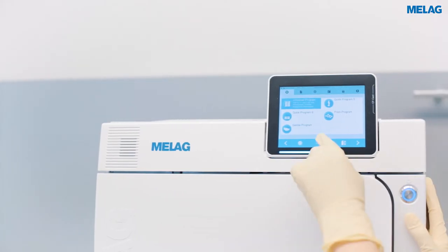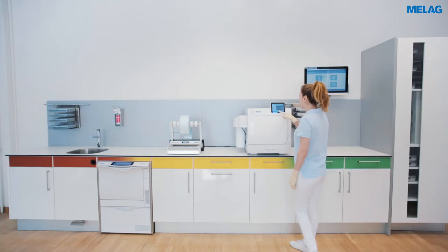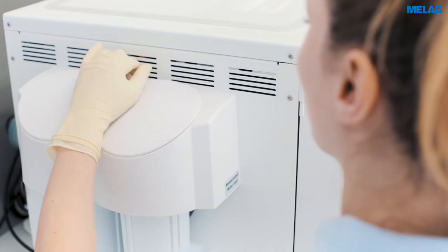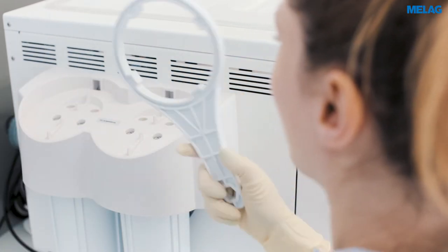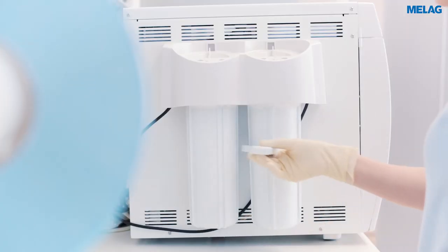Then start the universal program and abort it after about 20 seconds. You can now open the cartridge container using the wrench in the housing cap of the Meladem 40. Please slide the wrench over the cartridge container and turn it clockwise.